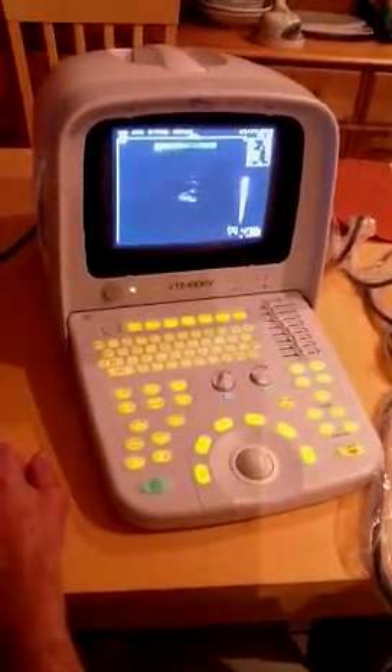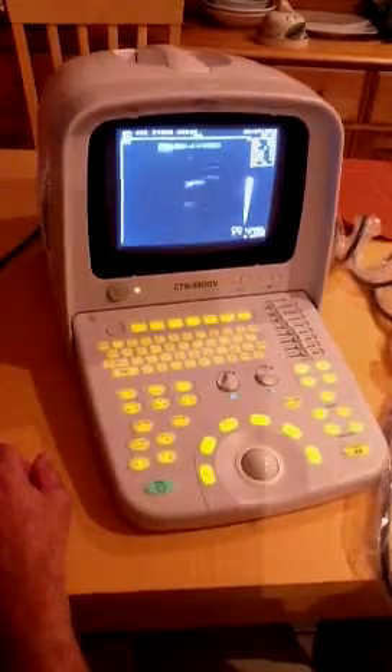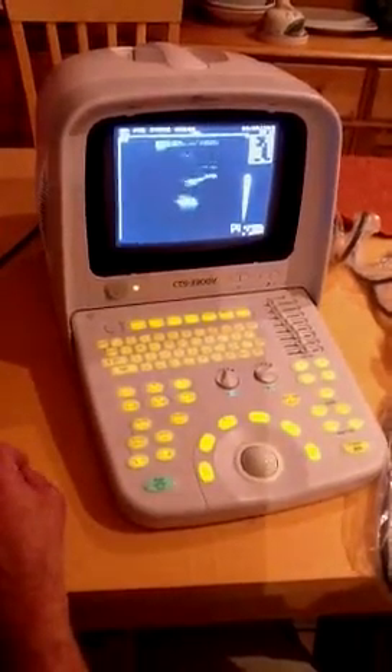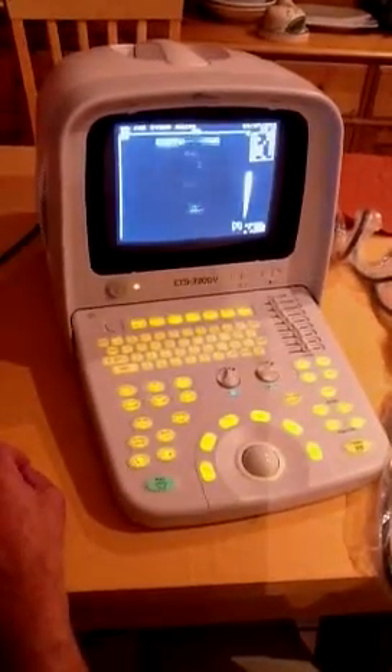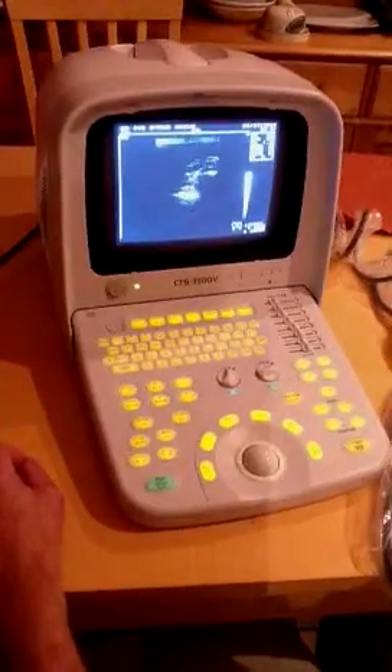This is the Shoei CTS 3300V. It's a specially dedicated version of the unit for veterinary use. There are two ports on the side for probes, so you can use two probes at any one time.